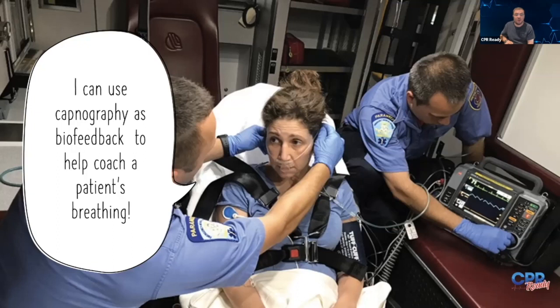So how can you use capnography for this? It's not going to diagnose whether it's necessarily a panic attack versus something else. But if you really do your good assessment and you have a reasonable belief that this person has low risk factors, they have good health, all of my other assessments are coming back, and this really seems like a true anxiety attack, a panic attack, they're hyperventilating, right? Capnography can be used as biofeedback. This is a really cool use of that because we've all been there, right?